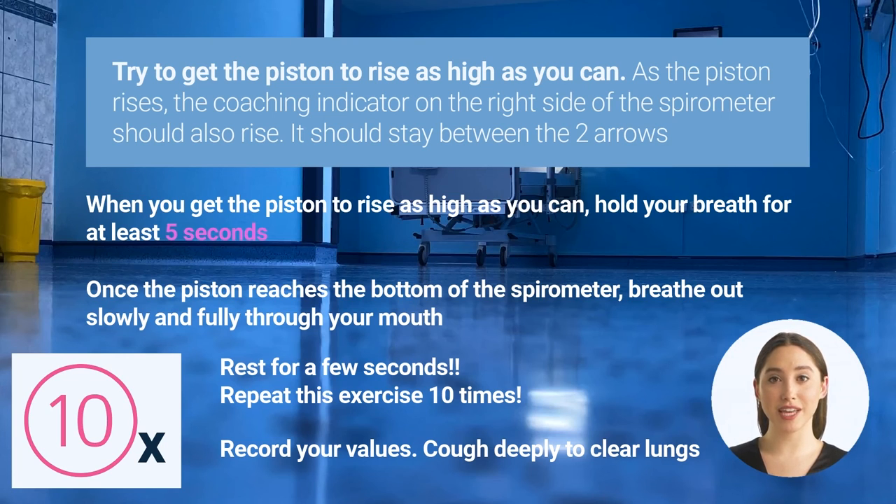Let the patient know they should try to cough deeply a few times. As you're coughing, hold a pillow against your incision to help with the pain. Coughing is good for the post-op patient — it will help loosen secretions and bring up any mucus in your lungs.